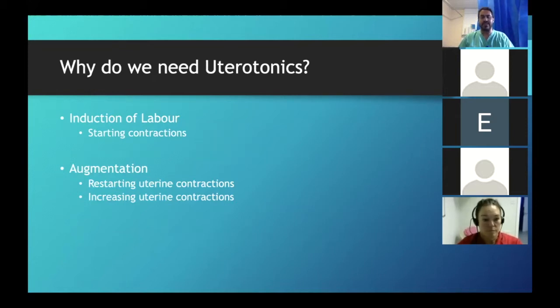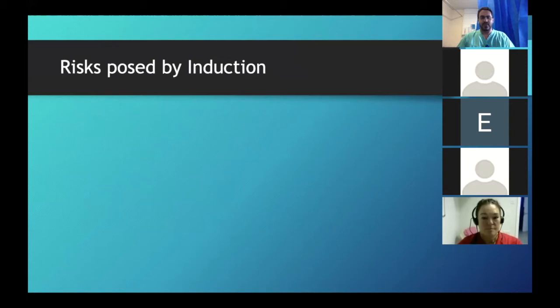The reason I'm saying this is because each and every one of these is going to look different on the CTG. And the first part we said is we have to figure out what the clinical picture of our indication looks like on our trace. Does that make sense? Okay. So let's start with the induction, the first one. Somebody who's coming in who's being induced.